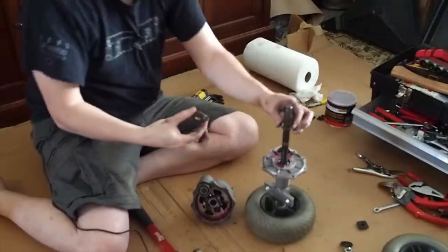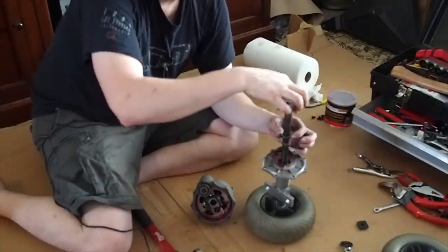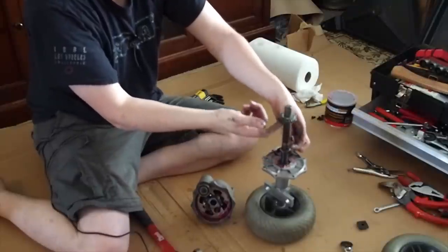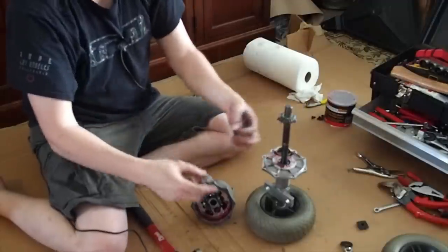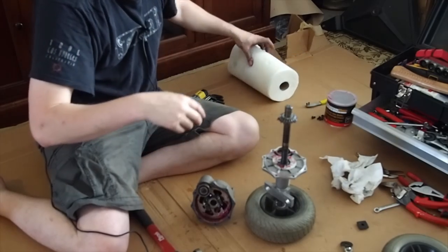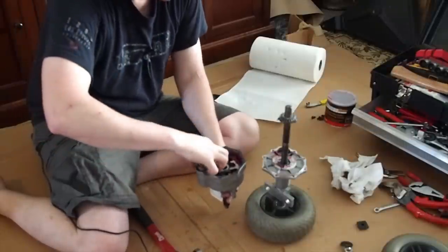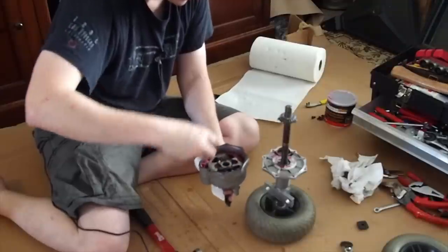There are a few bearings. There's this bearing here, and this gear here. This bearing here keeps separation between this gear and the shaft and the crankcase. Now, you can see my hands are going to get pretty greasy pretty quickly here. And there are a few more bearings like that. I'm going to pull this thing out for now.